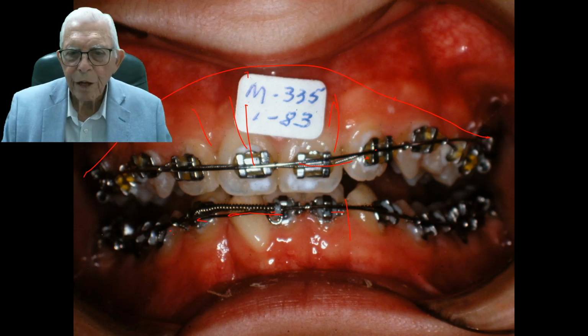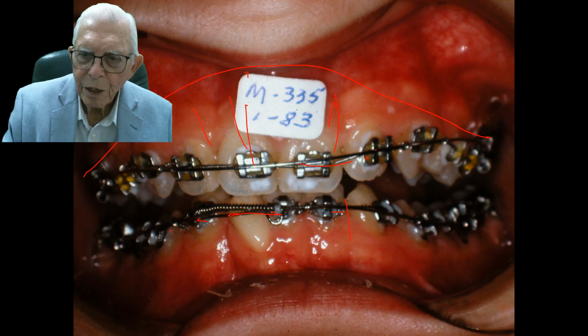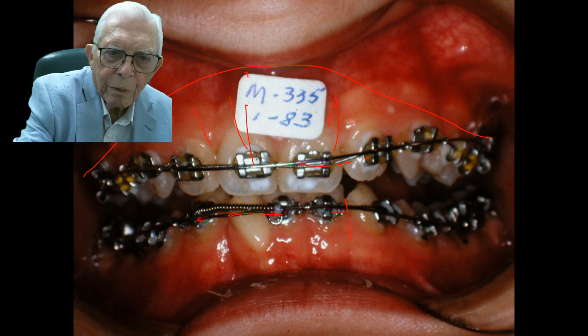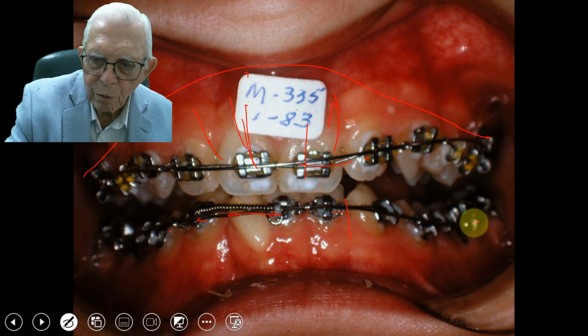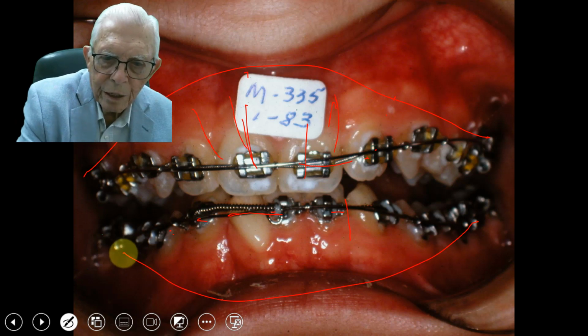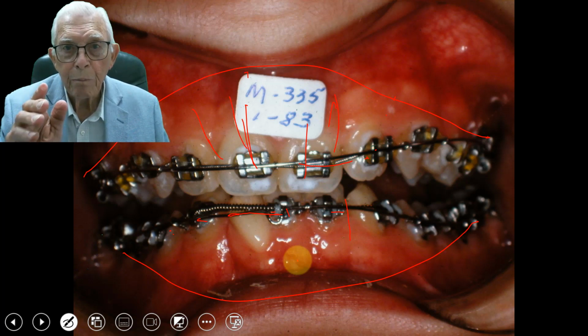Okay, sorry for that interference, and we'll get to go in here. We've got the intruding arches up above. Now this is going to pick these teeth up, and we've got one down below like that, and it'll bring those back.